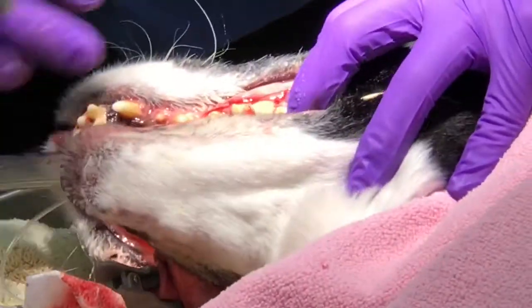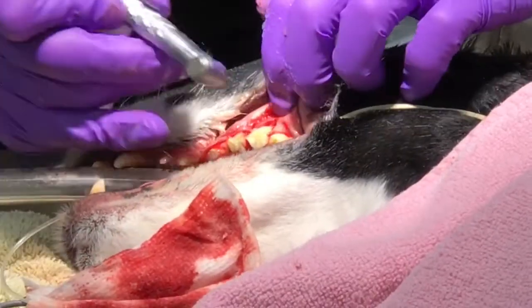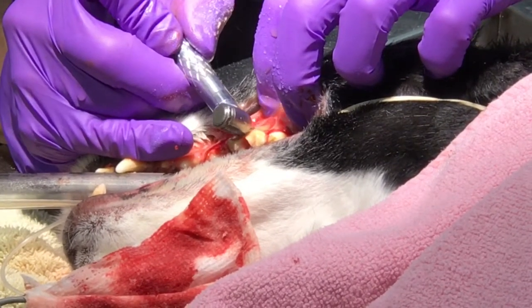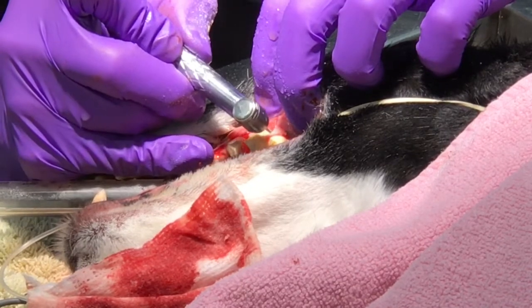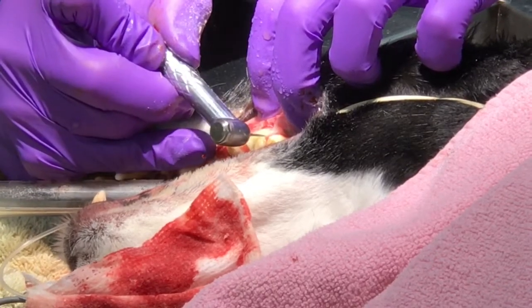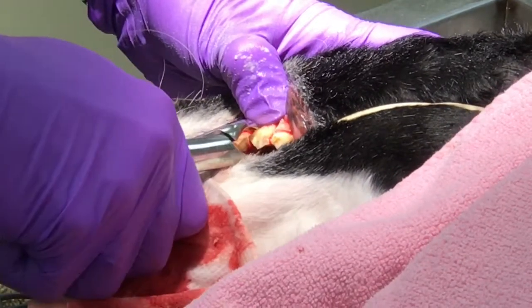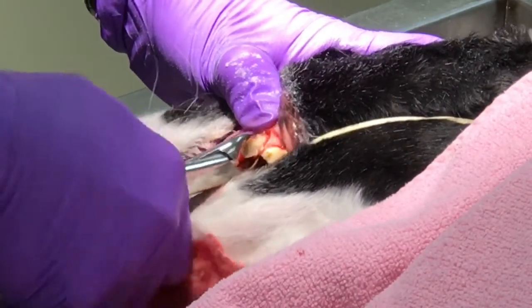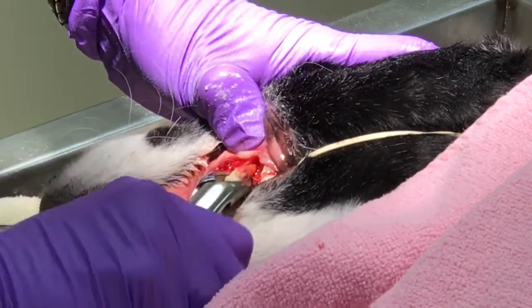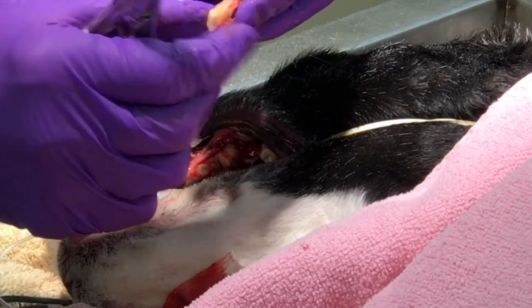So we're going to go for this big back root first. It's the largest of the 3 roots. Burr around it a little bit. And then remove that far back root there.